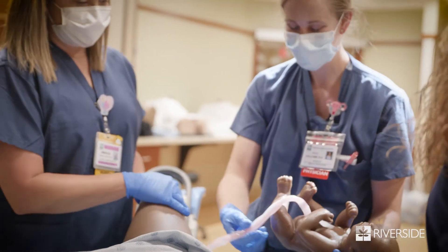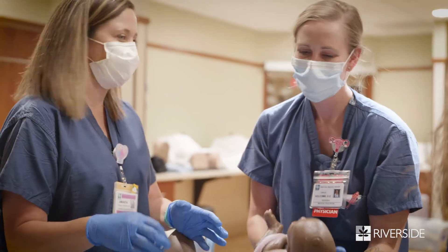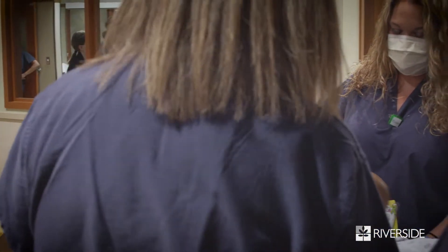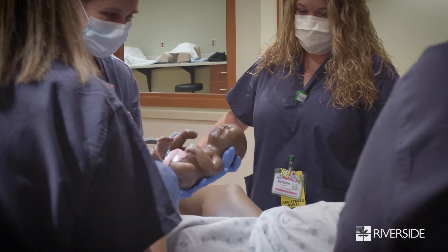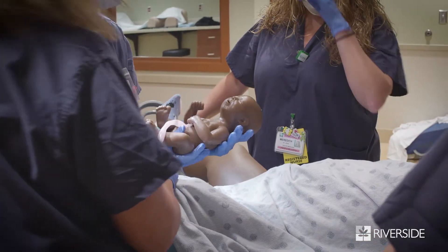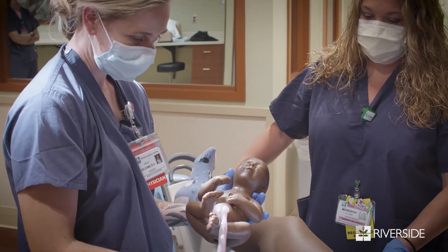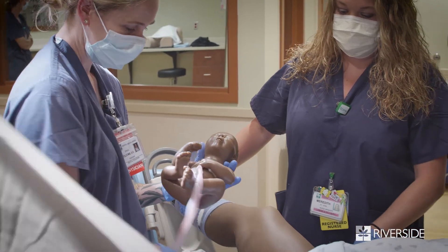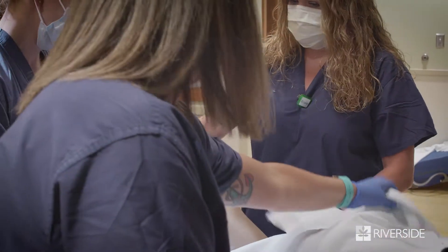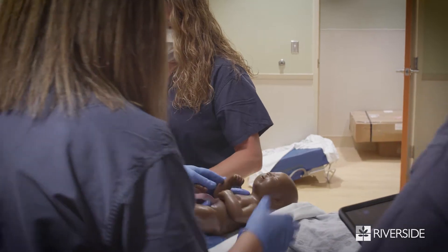That's stressful. Stimulate the baby — yes. I would put baby down — honey, you want to ask if she wanted skin-to-skin. Do you want skin-to-skin? I would have asked before clamping and cutting the cord. Okay, there's baby.